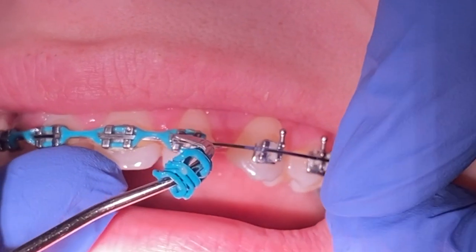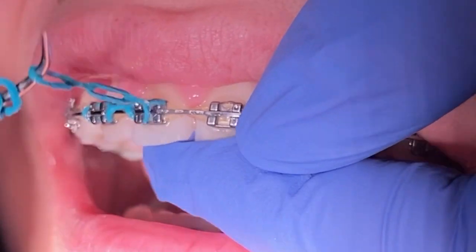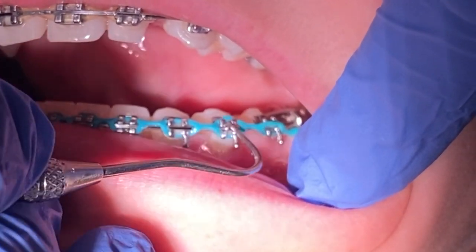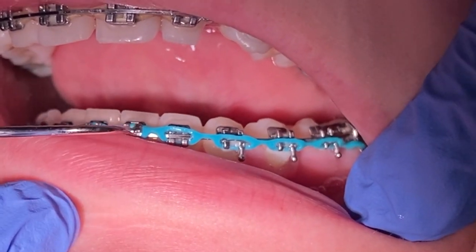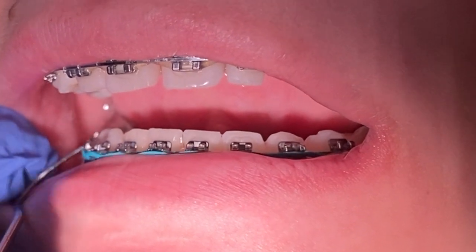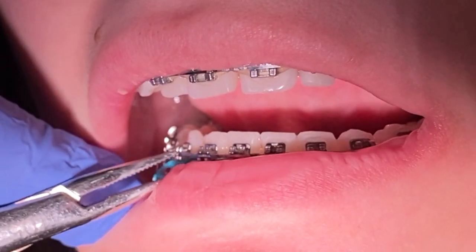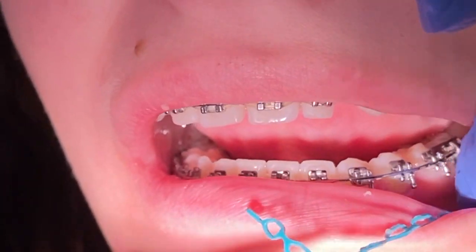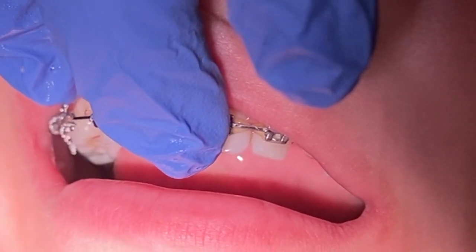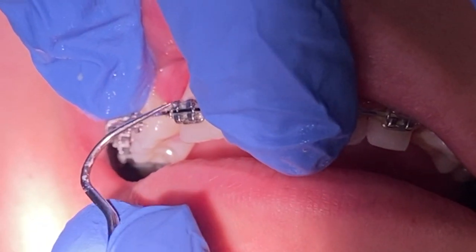There's no pattern that needs to be followed when taking off the colored o's by a dental professional — whether they want to go left to right, top and bottom, or remove one single at a time, that's perfectly up to them. As you can see here, we're removing what we call the ligature ties that we placed on these to help engage the wire better to the bracket, and it creates better activation in either rotating teeth or aligning the bite.